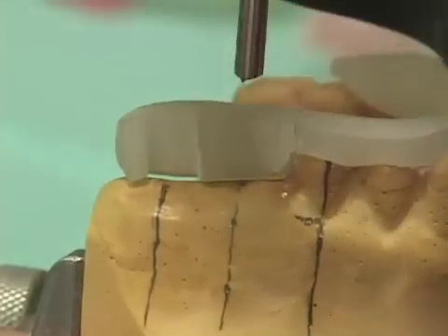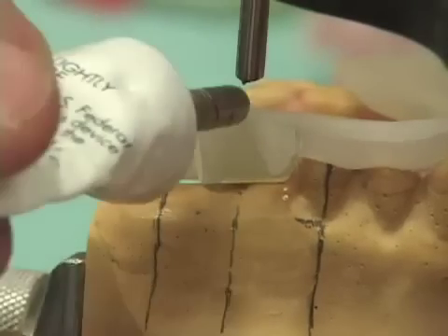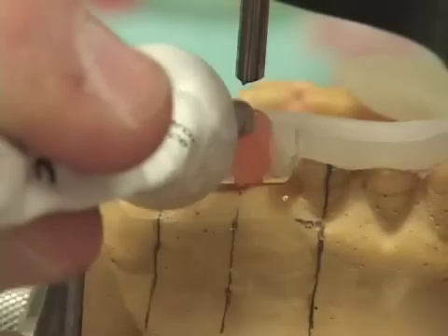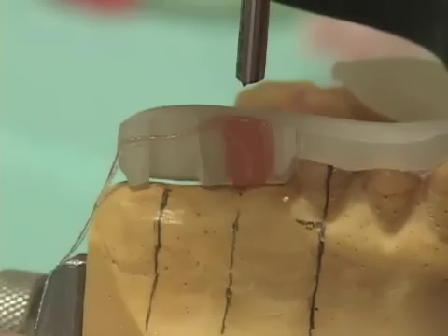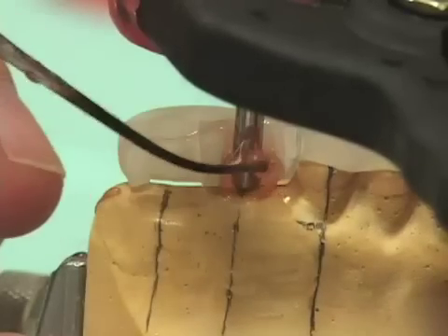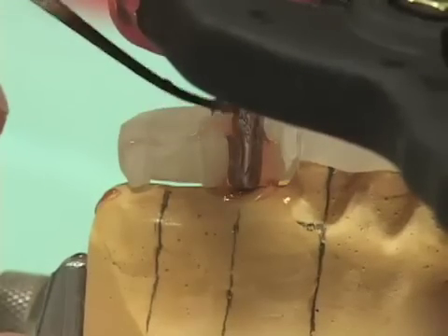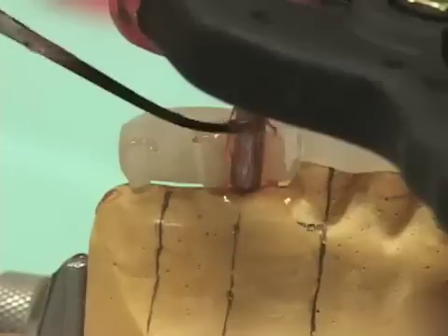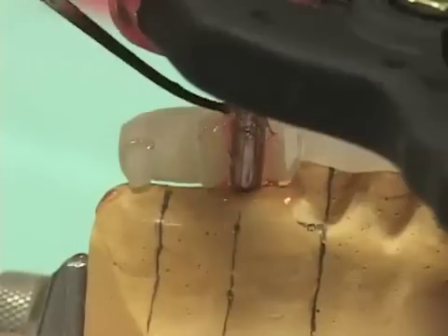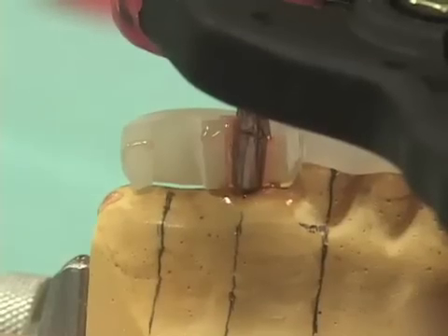When this comes clear, I lift it straight up without twisting it at all, and then we place some triad gel in this area. Without twisting or turning this at all, I lower it straight down in place. Using the PK-Thomas instrument, I coax and adapt the triad gel nicely to the lingual 180 degrees of this drill blank, and then cure it, just like we had done for the other ones.